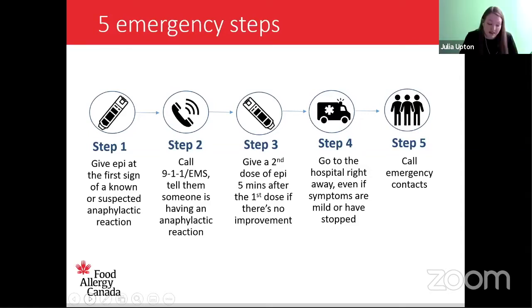So yes. Another question that came in from Renee, and she references that within first aid, they teach you to rub the spot after you've administered epi. Is this something that has to happen? And if so, why? So the idea of rubbing the spot is to increase the absorption of the medication from the muscle. And so it's a great idea if you can do it.